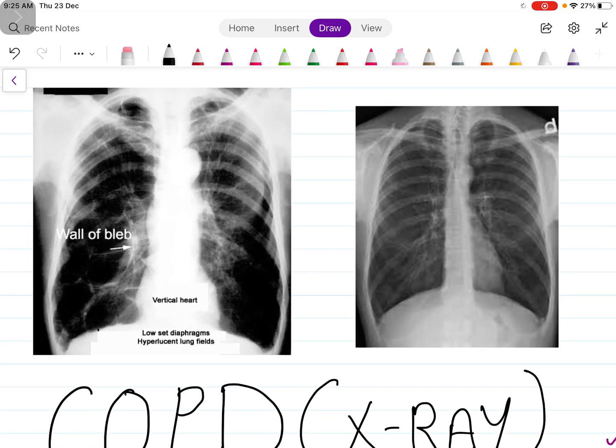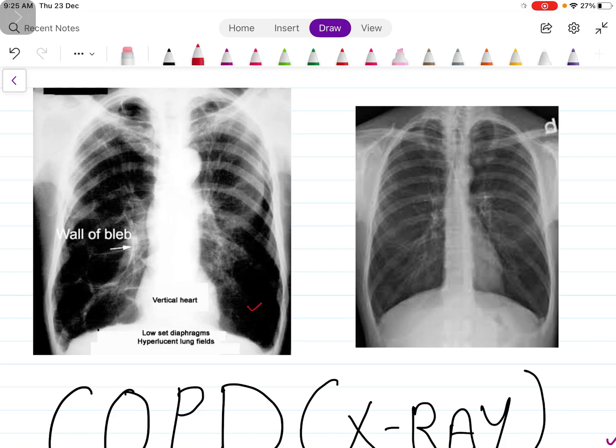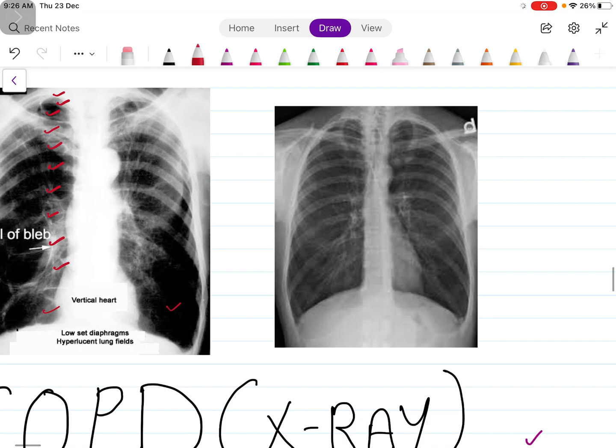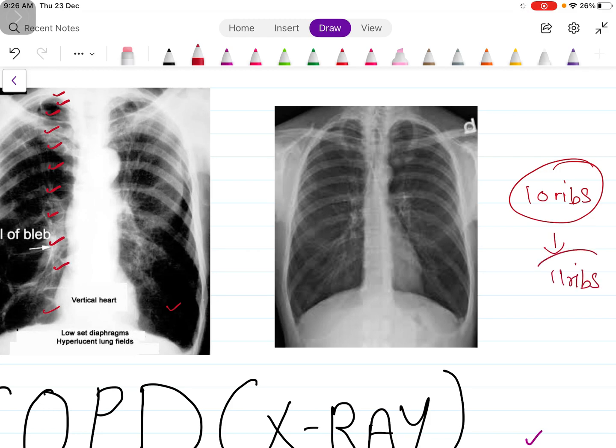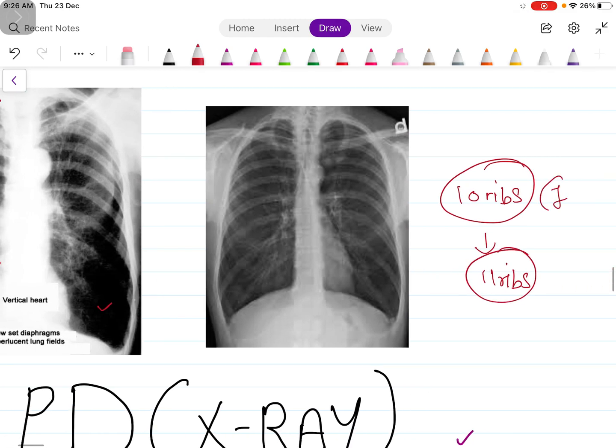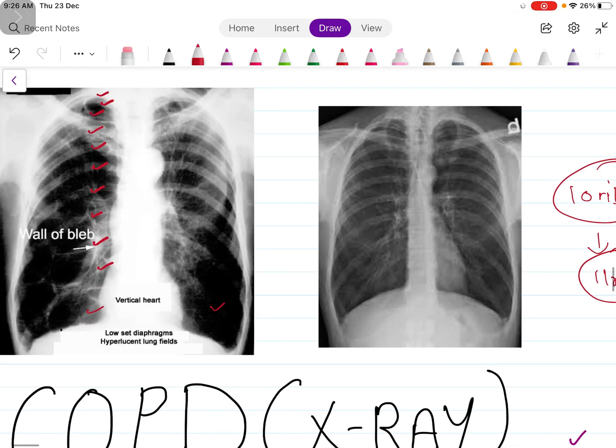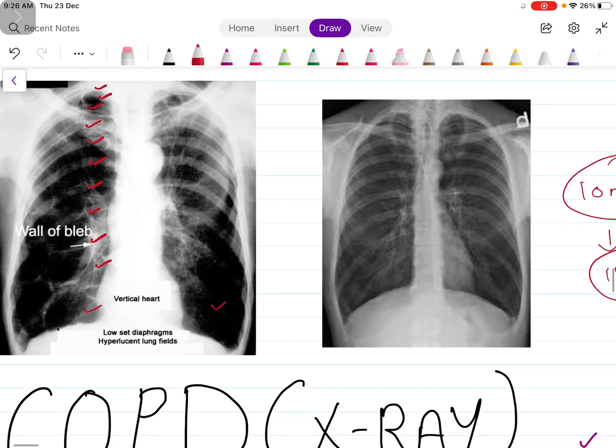So now let's compare with the x-ray. You can see that the lung fields become black here. Now to see that there is hyperinflation of the lung or expansion, we need to count the ribs. Now let's count it: 1, 2, 3, 4, 5, 6, 7, 8, 9, 10, 11. Normally how many ribs should be seen? That is 10 ribs. But we can see here 11 ribs, that means the lung is expanded. So first point is clear: there is hyperexpansion of the lung.